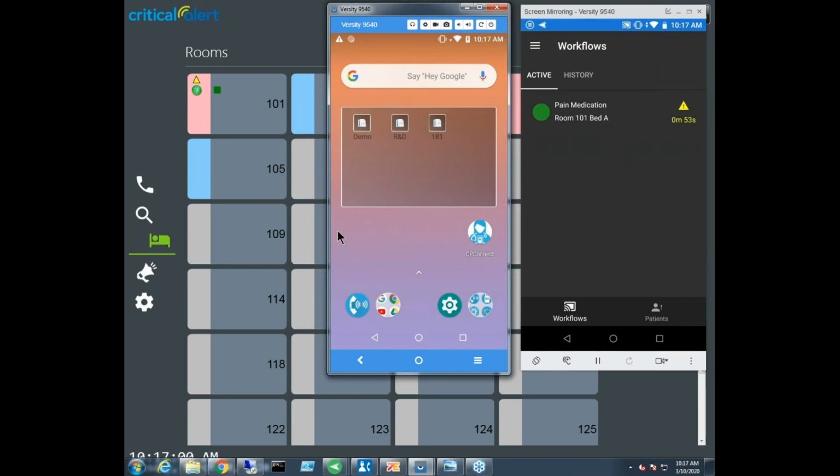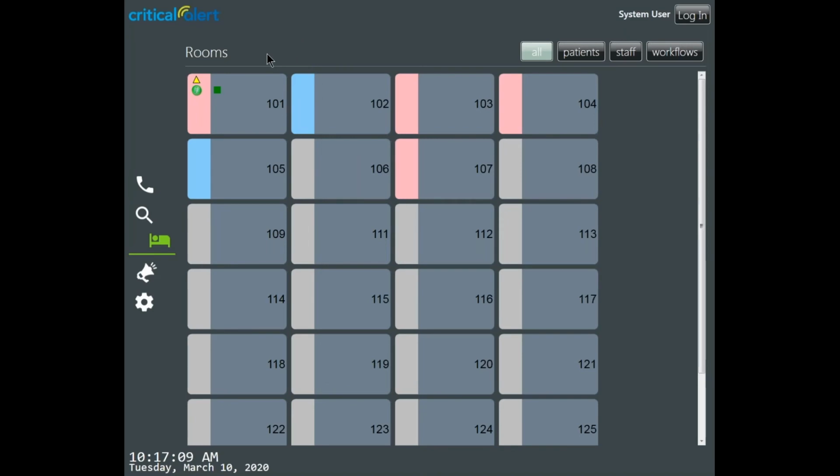And this is going to help with the overall escalation of that call and help get that patient response quicker, sooner than later, right? So I want to make sure that somebody's responding immediately to that notification.